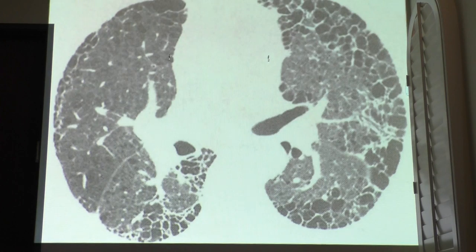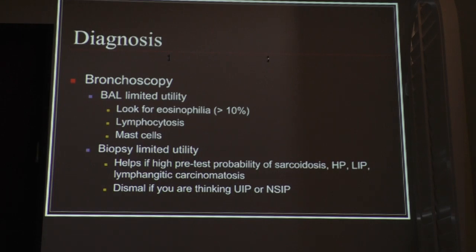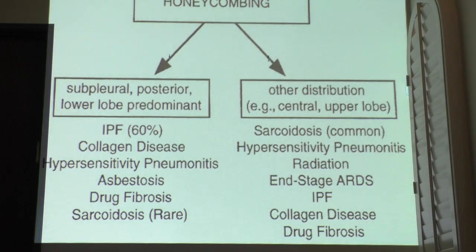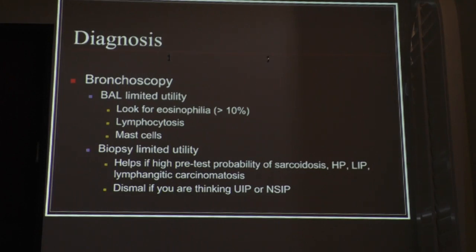It's basically these black lines. They're more like lines, looking like fibers, like collagen type fibers or elastic fibers. So it's just a ton of these little black strands. Whereas ground glass is kind of thin, almost like when you have really fine bubbles in soap.